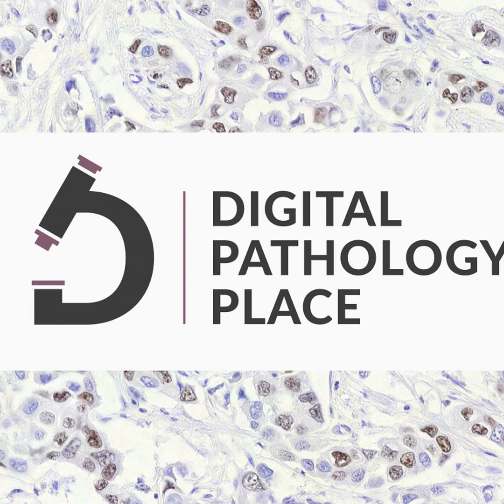But we should be careful if the tasks are a little bit more complicated, for example molecular marker prediction. Then sometimes attention can also be confusing. The neural network is paying attention to regions where a pathologist would think, I have no clue, there is nothing relevant there. And then you have to be careful that you don't explain the attention map yourself, because then the network is not explainable, but you are explaining what you think the network is doing. So then you are explainable, but not the network.